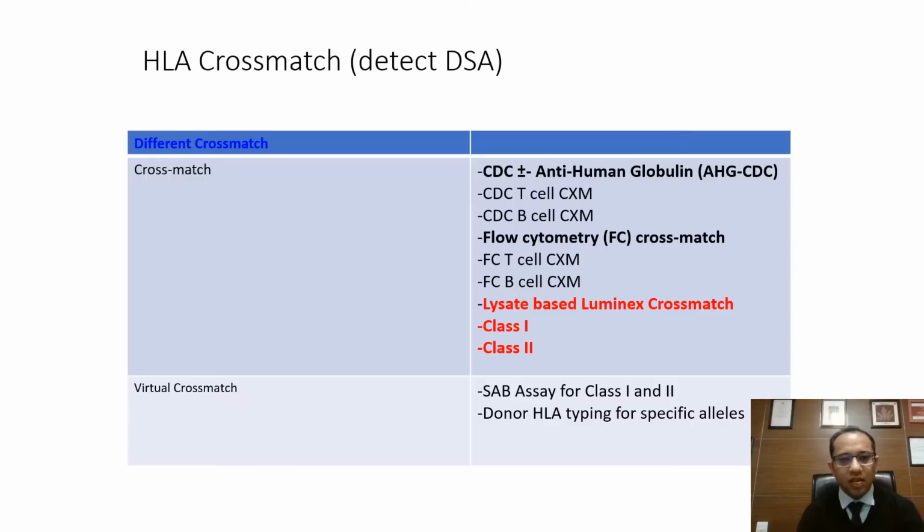So what are the cross matches that are available? Different cross matches. First is CDC cross match, flow cross match. You have a lysate based Luminex cross match we are discussing.